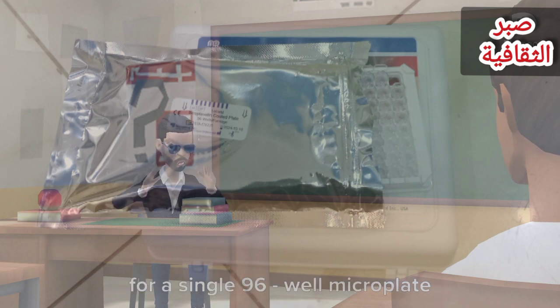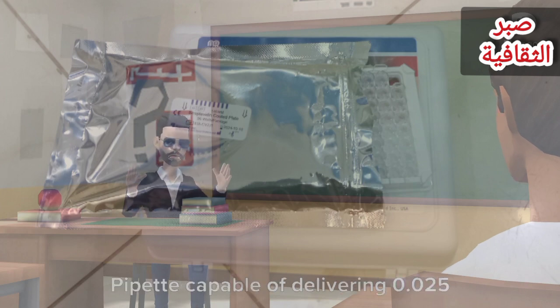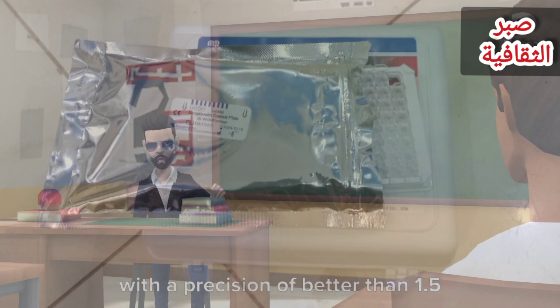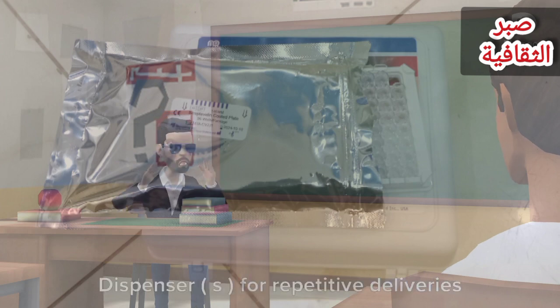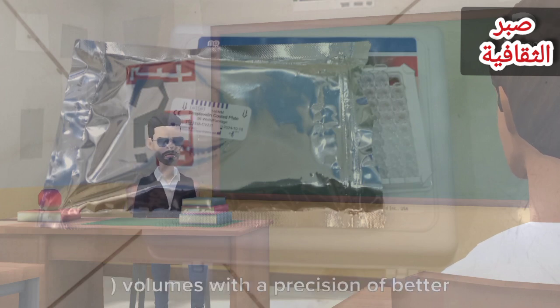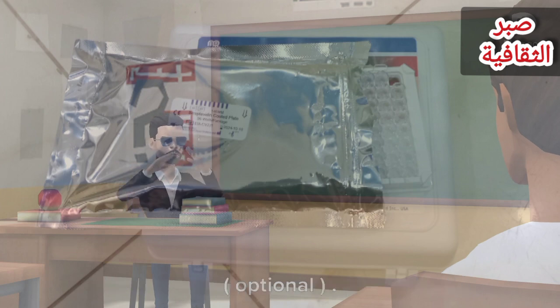4.1 Required but not provided. 1. Pipette capable of delivering 0.025 and 0.050 milliliters (25 and 50 microliter) volumes with a precision of better than 1.5%. 2. Dispenser(s) for repetitive deliveries of 0.100 and 0.350 milliliter (100 and 350 microliter) volumes with a precision of better than 1.5%. 3.